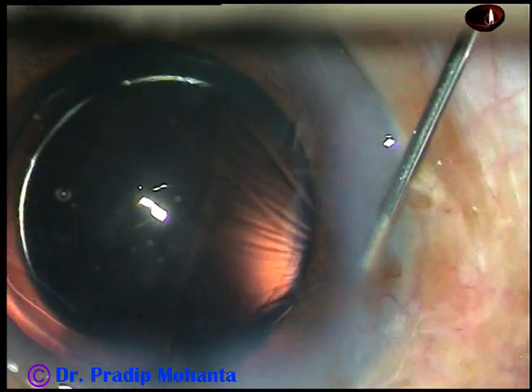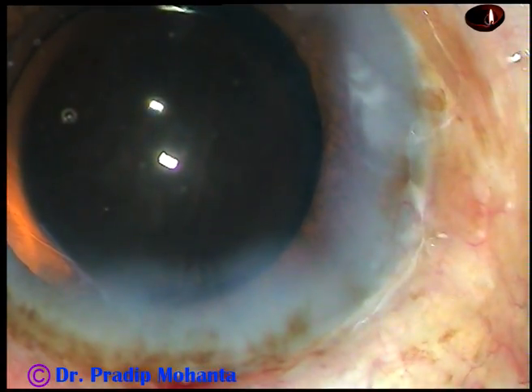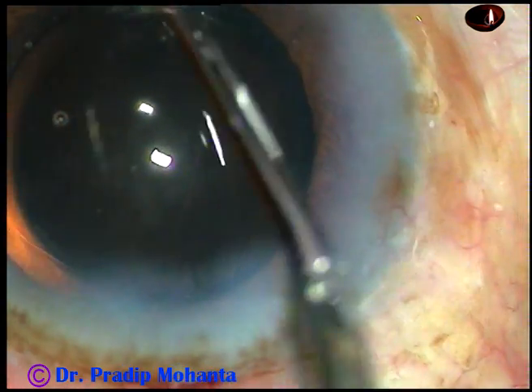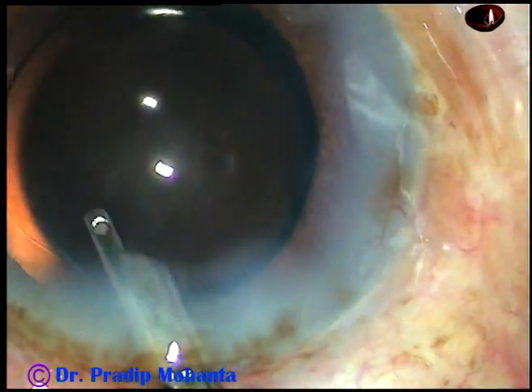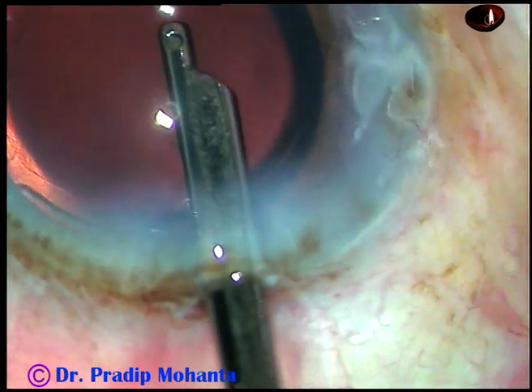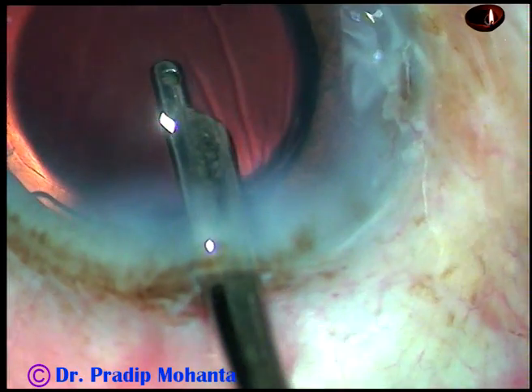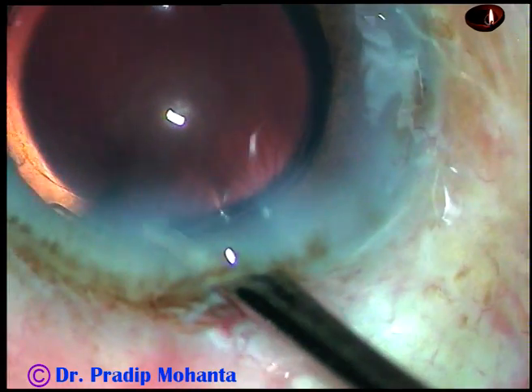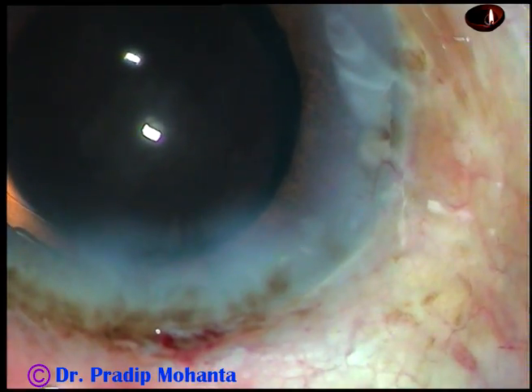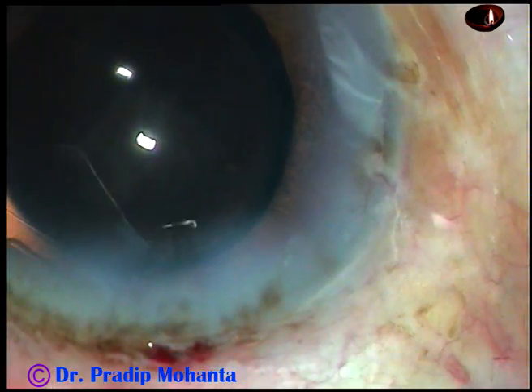Now the side ports are being hydrated. A bit of moxifloxacin has been injected before this hydration. And now this is the final lavage of the anterior chamber. The anterior chamber is nicely formed, and then the integrity of the wounds is checked. There should not be any leakage from any side.